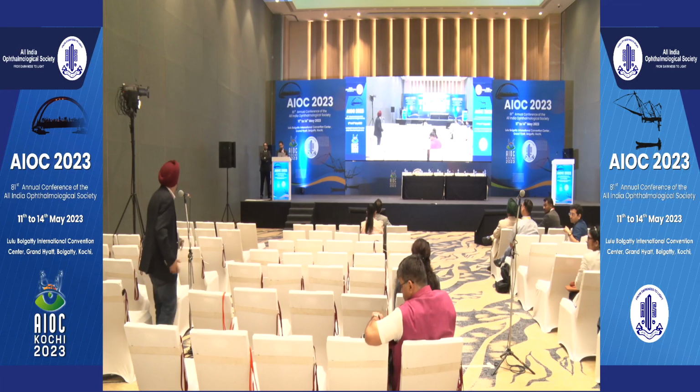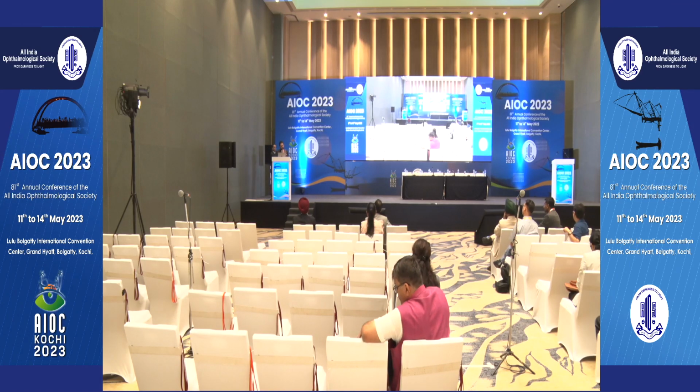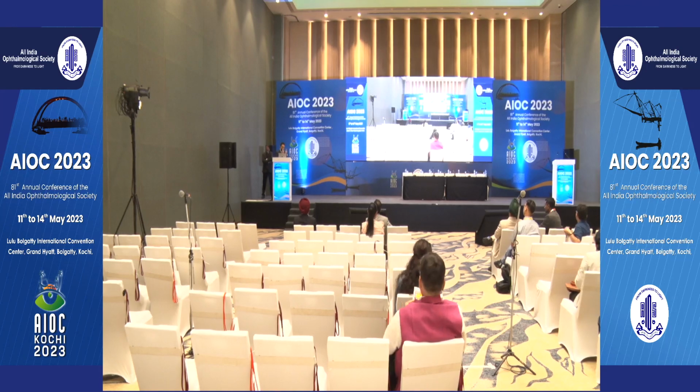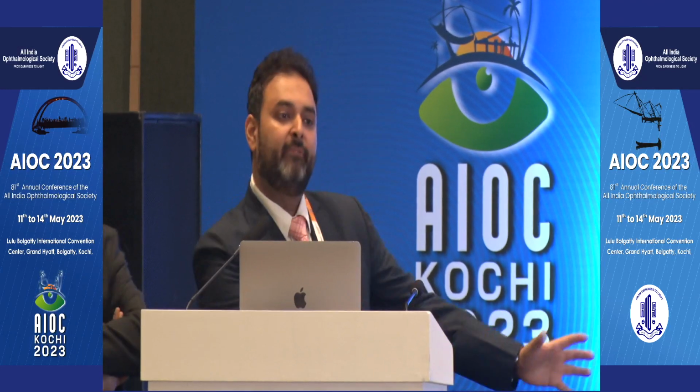Absolutely, sir. And just to round off the discussion, on post-op day one, in a diabetic vitrectomy, a complex one at that, where membranes have been removed, or you have done a lot of premacular hyaloid removal and blood removal, you get fluid in the macula. I think three things come to mind. One is a retinal break, which you did not notice. Although you'd be struggling to come up with a case from your recollection where on post-op day one, even if you had a break which you did not detect, you have an RD in a diabetic case.